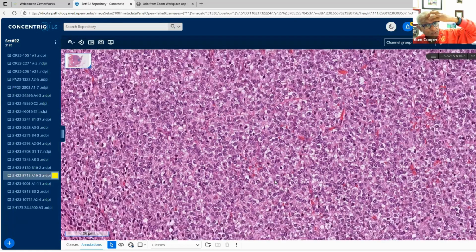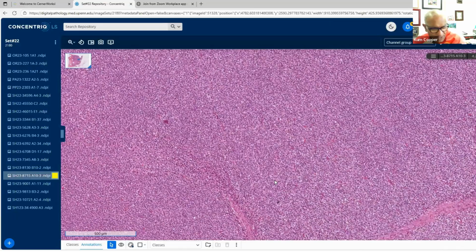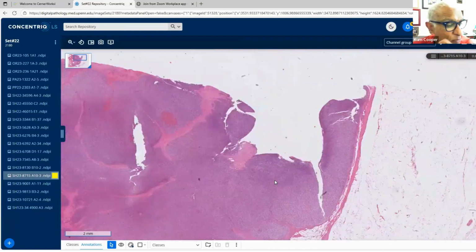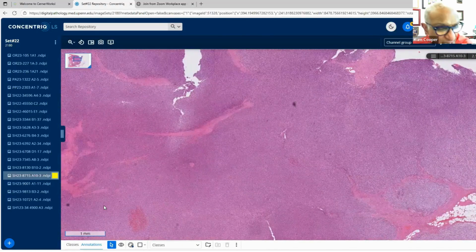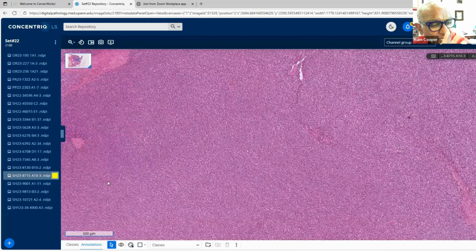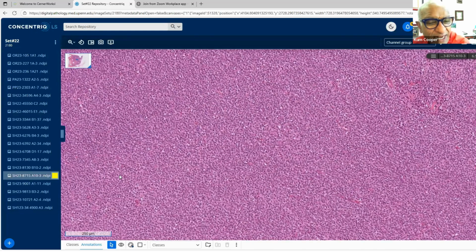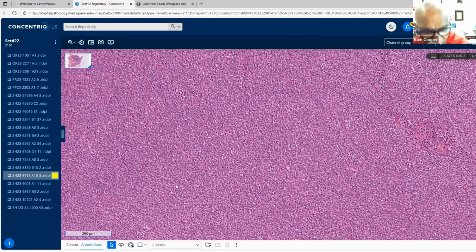And you all know that clear cell sarcomas demonstrate melanocytic markers, S100, SOX10, HMB45, and Melan-A, and they have a distinct molecular profile as well. So clear cell sarcoma is the EWSR1 and CREB family. So let's get clear cell sarcoma out of the way, because we all have melanocytic markers. They are all negative. All right. I've got alveolar soft part sarcoma. When I think about that, I like to see large pink cells with large nuclei, much larger than these, with prominent nucleoli. But that's a good thought.